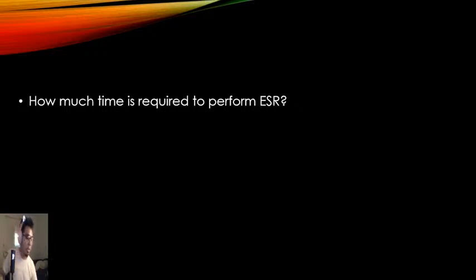All right. So it's a good way for us to do ESR analyses at a faster rate because it's 20 minutes instead of 60 minutes. But if you're doing the manual methodologies, it's usually an hour.